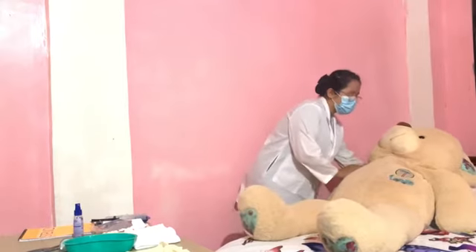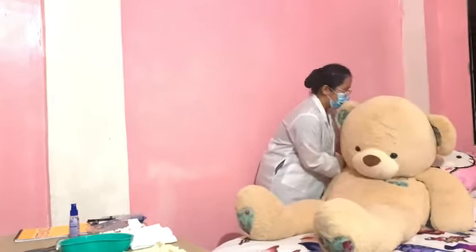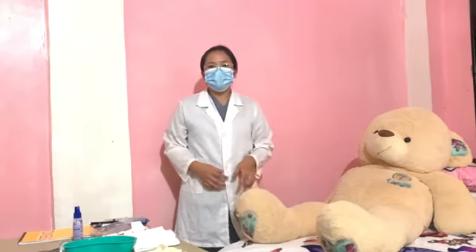So, assisting po, ma'am. 1, 2, 3. Ito po, ma'am. And then, drape the chest with a bath towel or disposable pad and have an emesis basin and tissue handy.